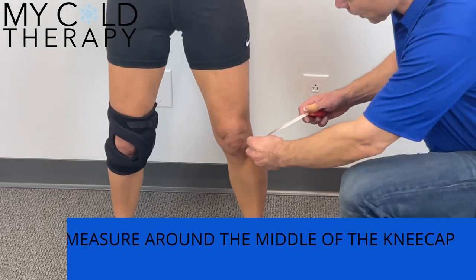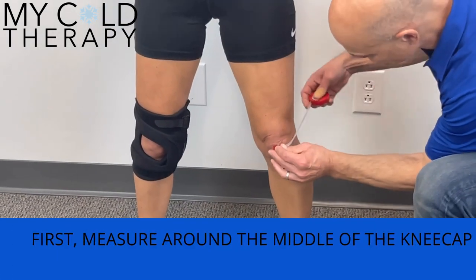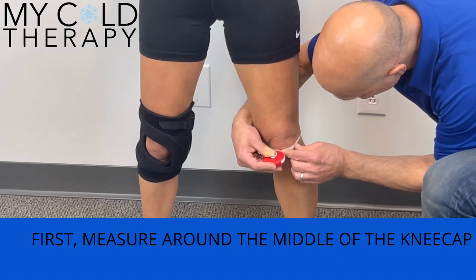First thing you want to do is get a measurement around the middle of the kneecap. Take the tape measure, measure around, and take that measurement.